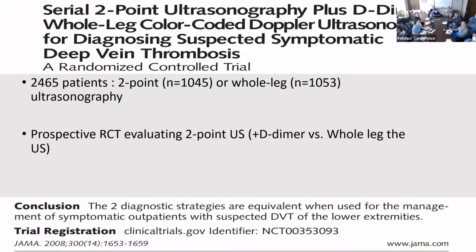And you might ask, well, what are we missing here? Is this 2- or 3-point exam as good as a color-coded Doppler exam done by the vascular lab? In my opinion, the answer to that is no, our exam is not as good. But there is some data that would suggest that using serial Dopplers plus D-dimer is as good as a full leg DVT study. This study was published in 2008 in JAMA.